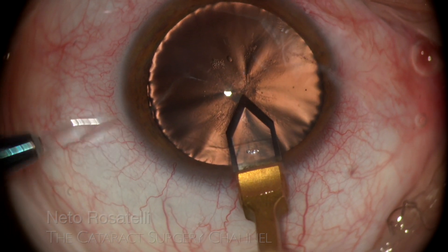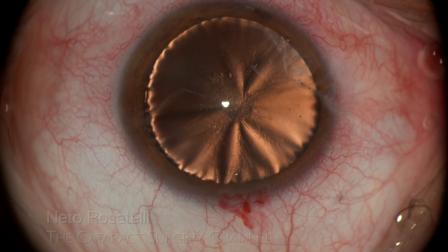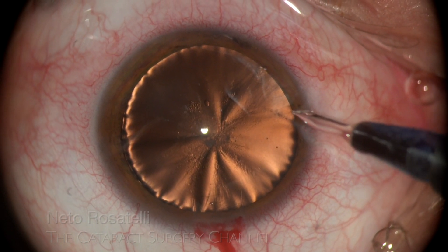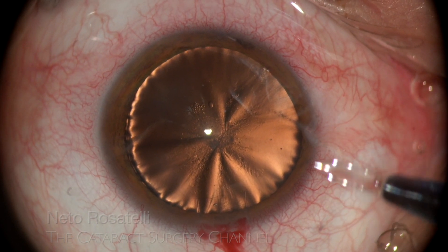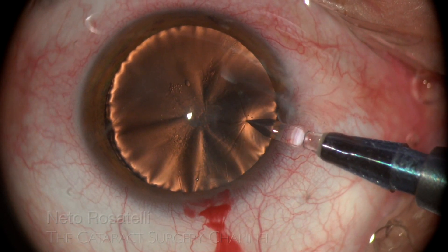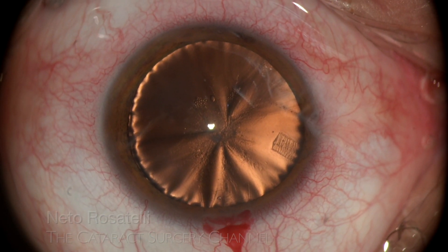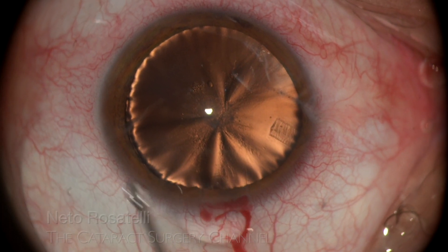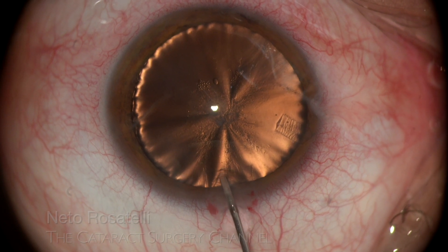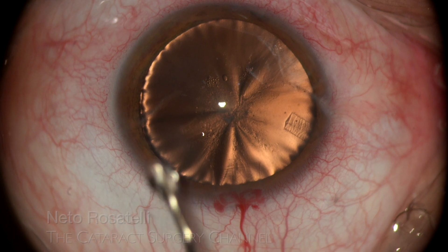After dispersive OVD on the cornea, the main incision is made with a 2.65 diamond knife and left and right side ports done with a 1mm sapphire stab knife. Since zonular issues are expected, I made a second side port so bimanual IA can be used if the need arises. The right side port ended up being a little too long.